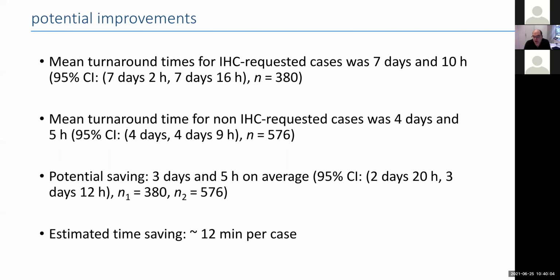12 minutes per case. Now, we don't argue that this is a universal model that can be applied without optimization at different clinical sites, because local guidelines might differ. But we just wanted to make the case that a tool like this can lead to workflow improvement.